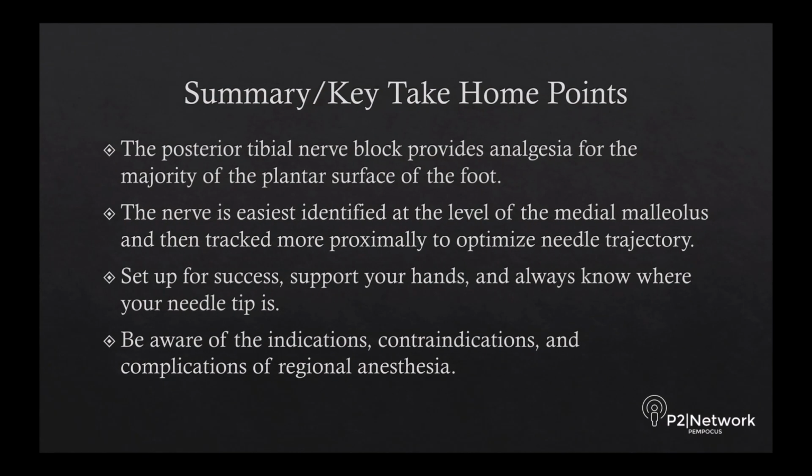In summary, a few key take-home points. The posterior tibial nerve block provides analgesia for the majority of the plantar surface of the foot. The nerve is easiest identified at the level of the medial malleolus and then tracked more proximally to optimize needle trajectory. Set up for success, support your hands, and always know where your needle tip is. And lastly, be aware of the indications, contraindications, and complications of regional anesthesia when performing this or any other peripheral nerve block.